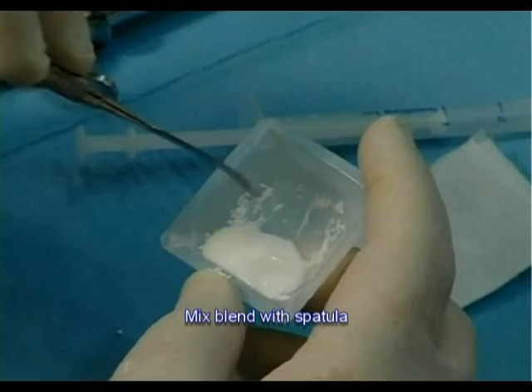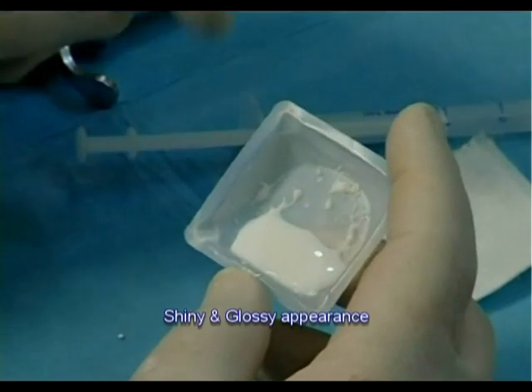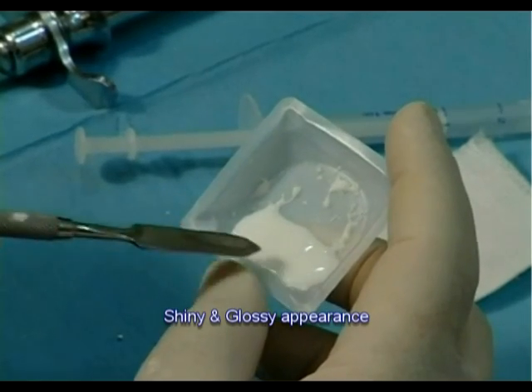Continue mixing until obtaining a homogeneous creamy texture. The texture is ready when it is well mixed and has a shiny and glossy appearance.